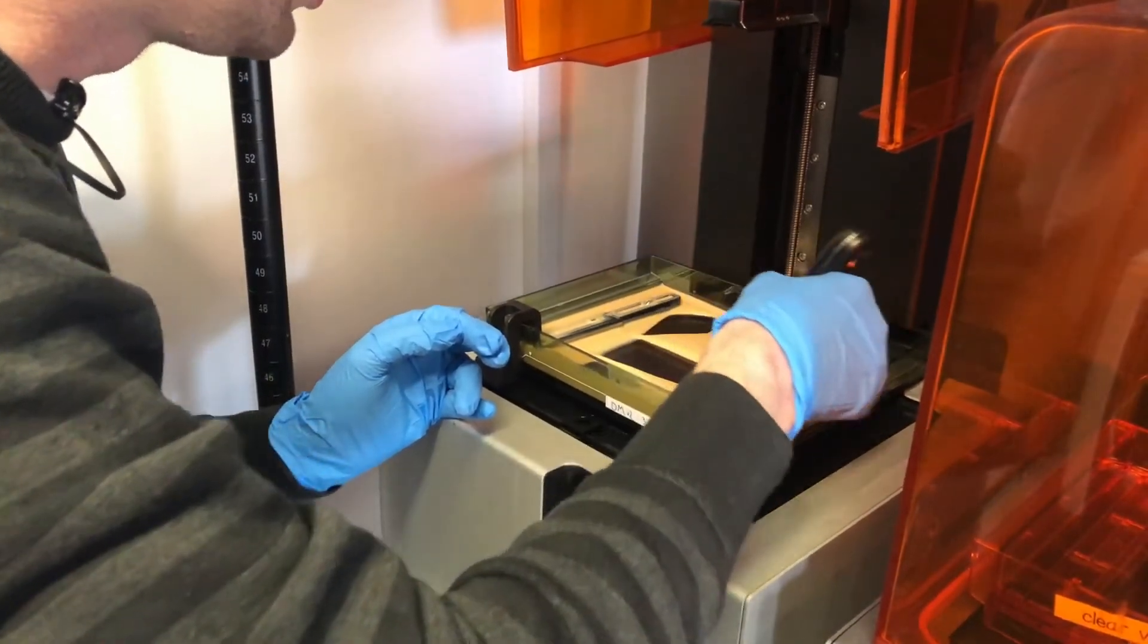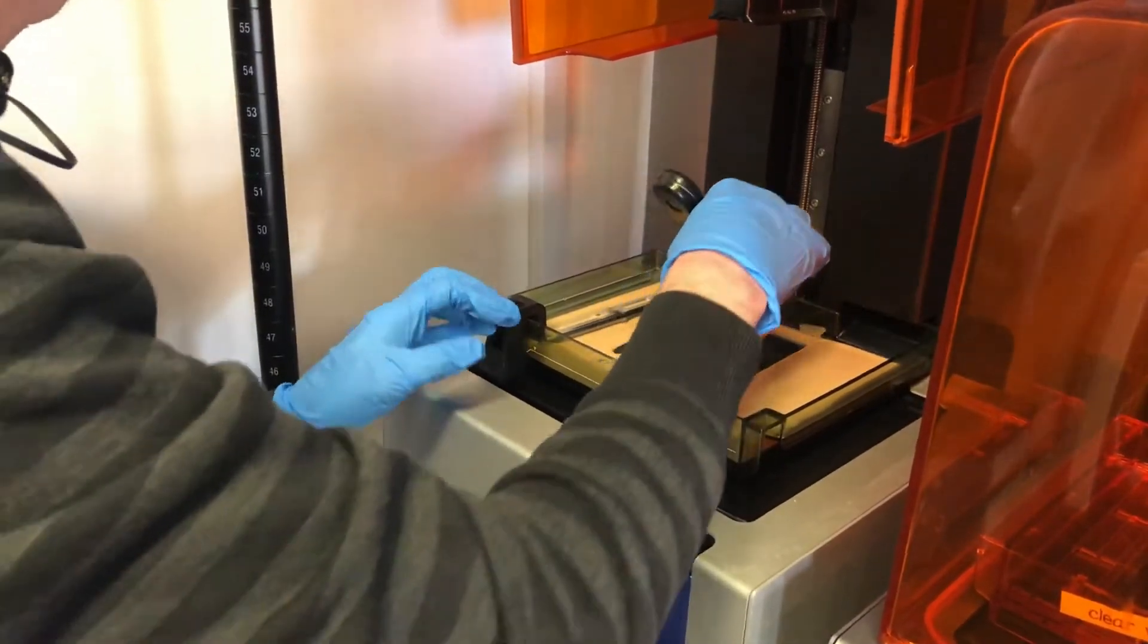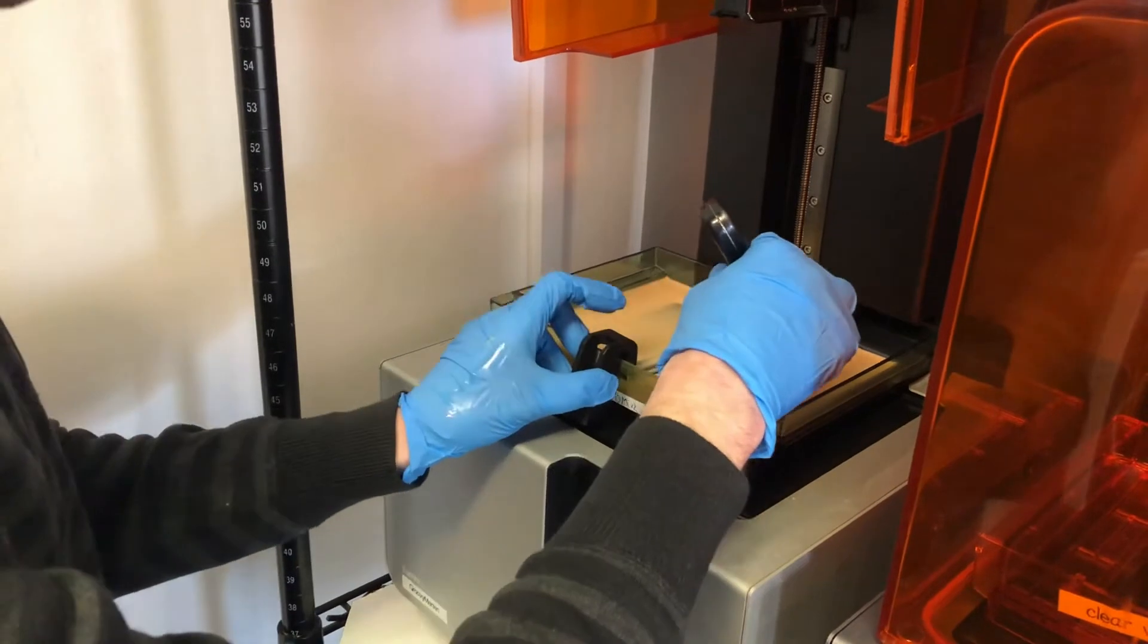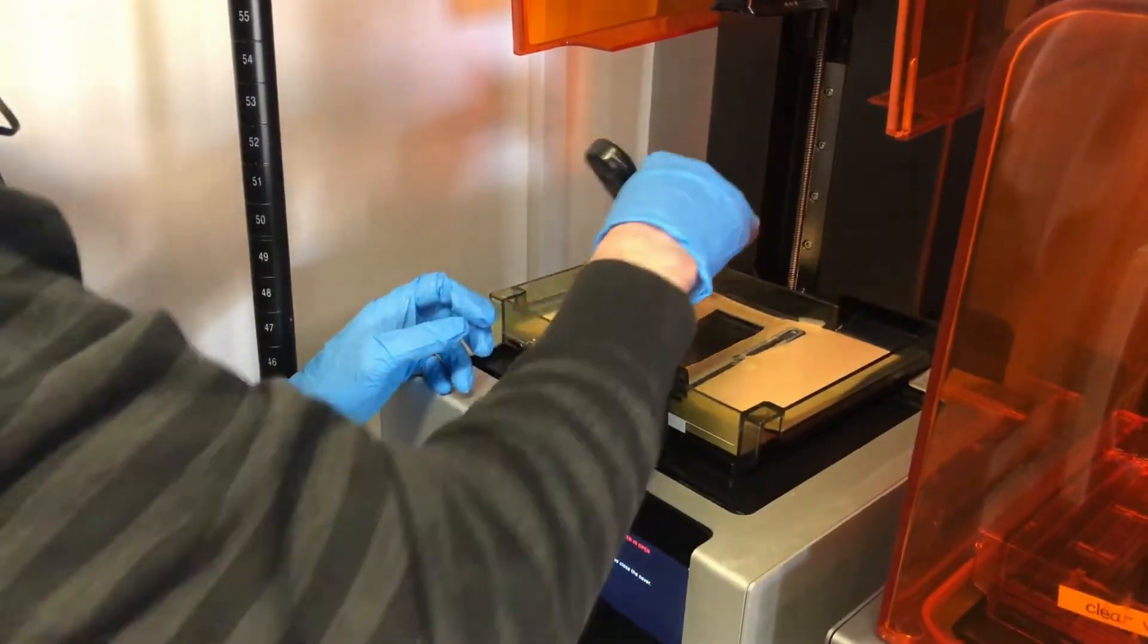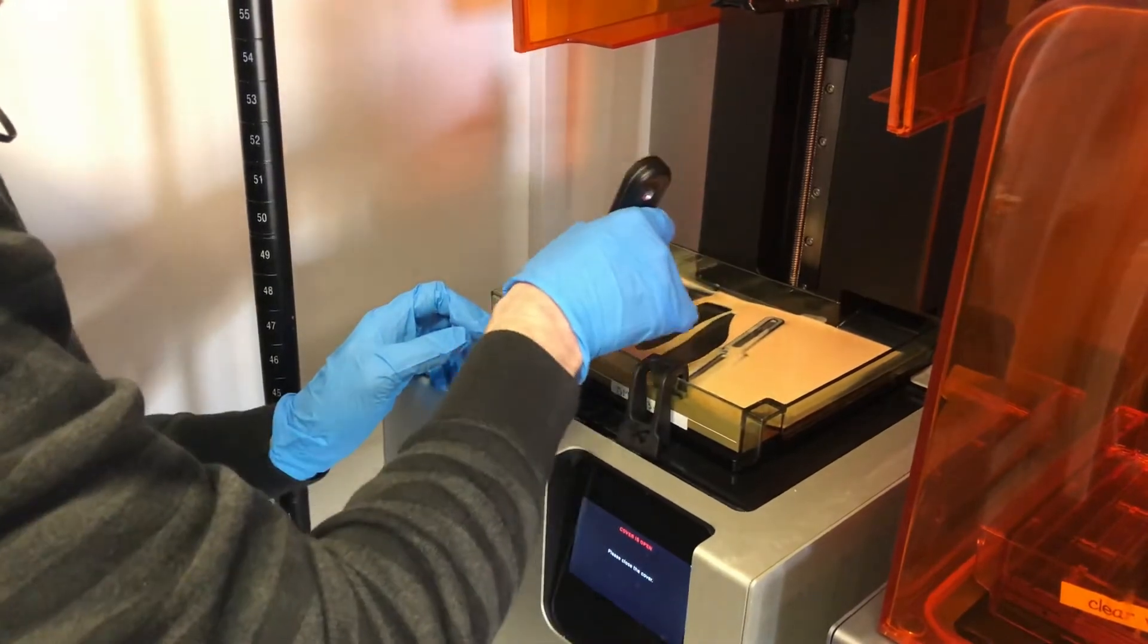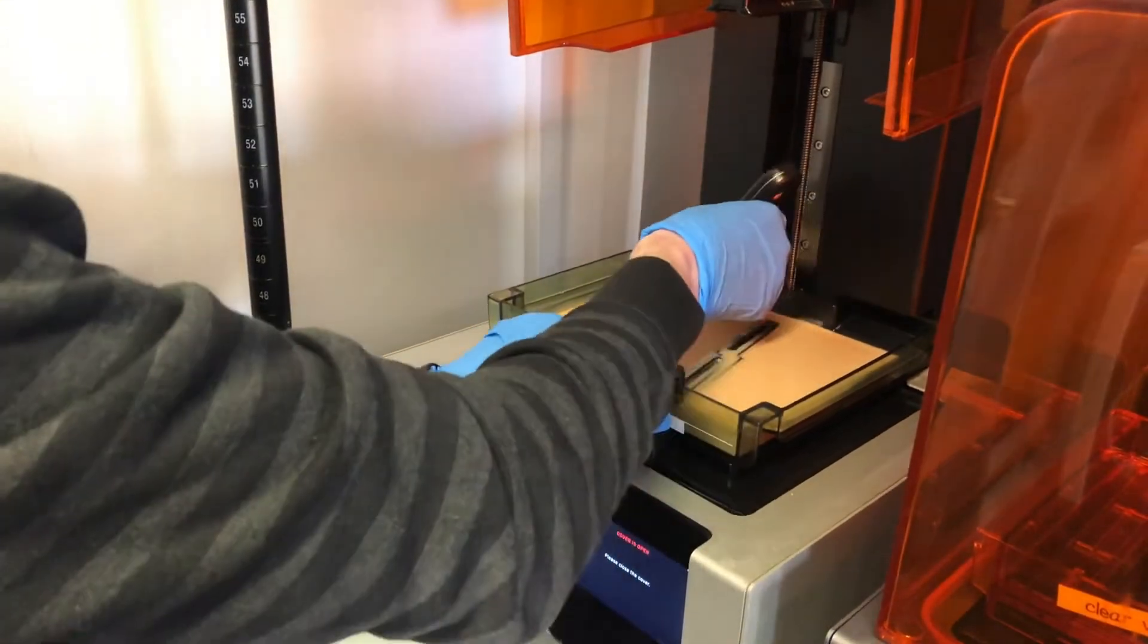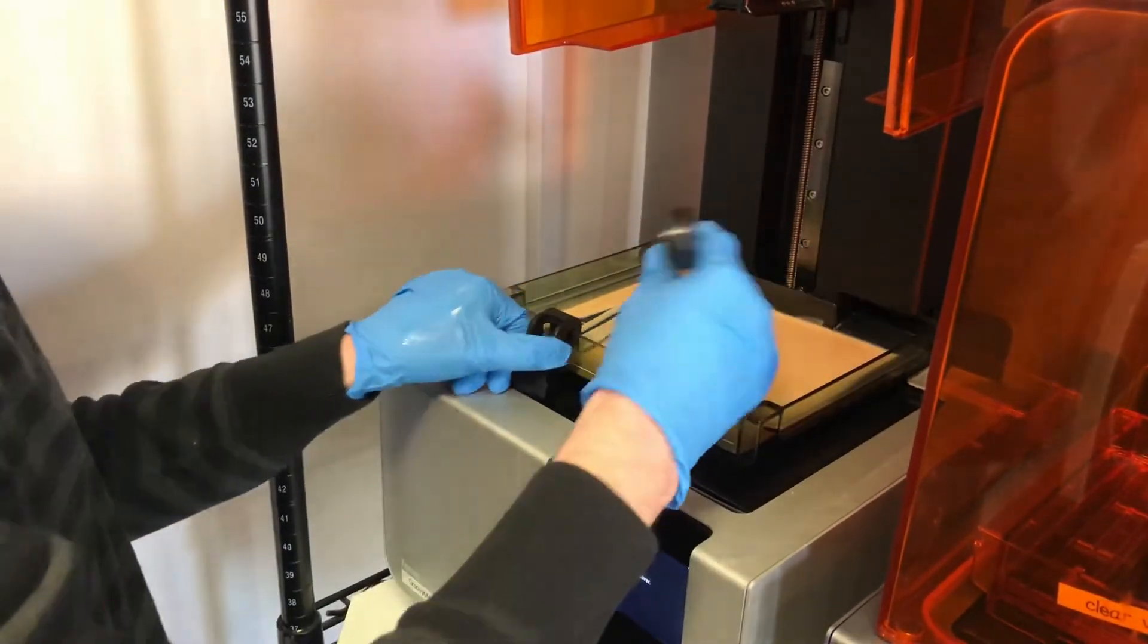This is getting anything that's sort of settled to the bottom mixed up, so our optical path for the resin tank is as clear as possible. Go through the whole thing, slide it over to the left. This resin tank is in perfect shape now.